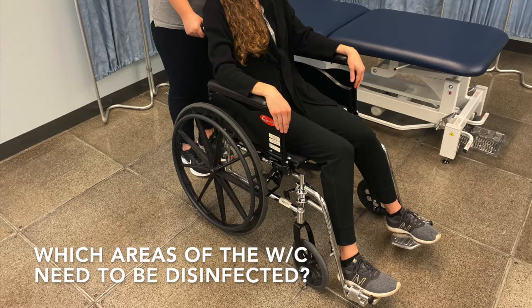Can you identify which areas of the wheelchair need to be disinfected? High-touch areas are surfaces that are frequently touched by the patient and healthcare provider. The following areas need to be disinfected more frequently.